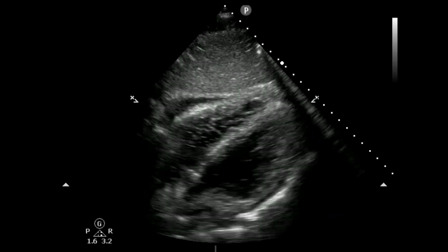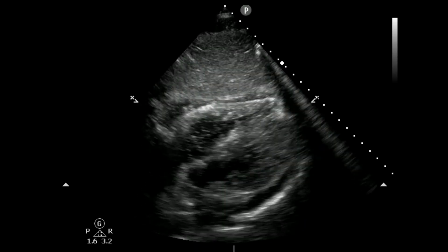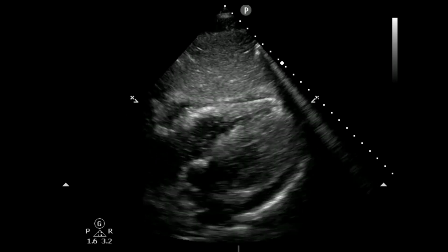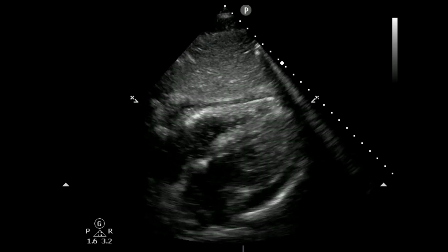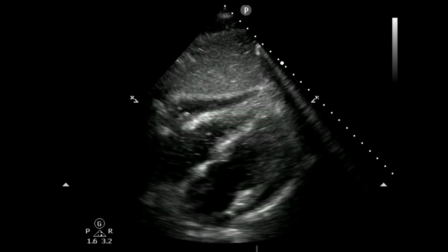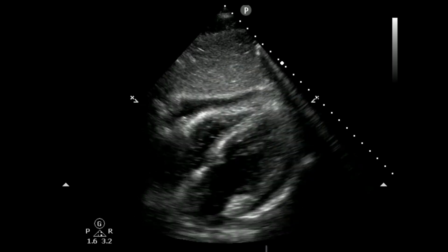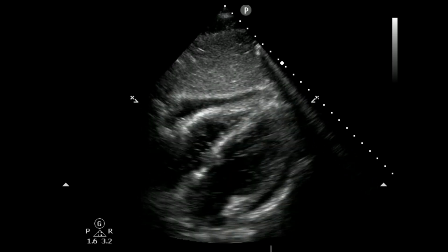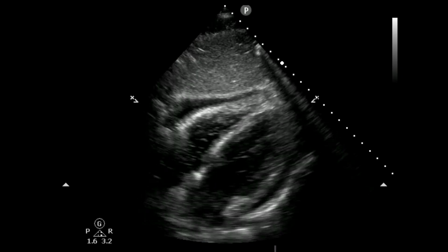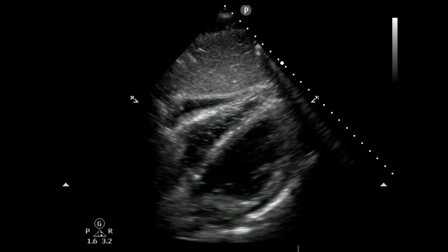And so if we want to look at some pathology, here's an example of a pericardial effusion in a patient. So you see the four chambers in a subcostal window, and you see some anechoic fluid that's circumferential to the heart that's still there throughout the entirety of the cardiac cycle, even when the heart is in full, large diastole, right? And you can even see some undulation of the right ventricular wall throughout the cardiac cycle, which is suggestive that this effusion not just exists, but it's causing some hemodynamic forces on the right heart, which would be suggestive of early or impending tamponade in this particular case.